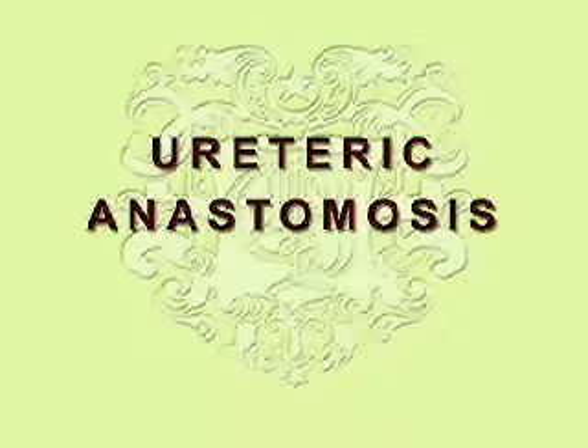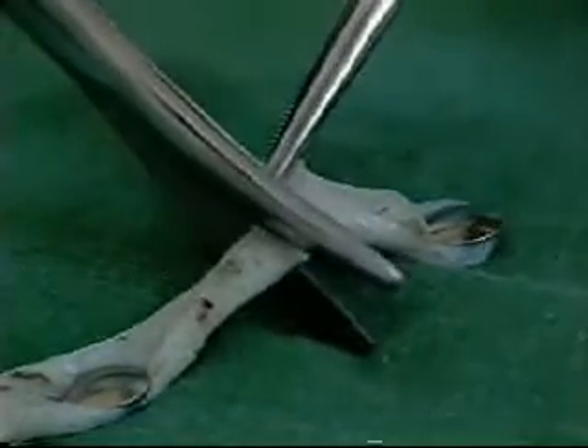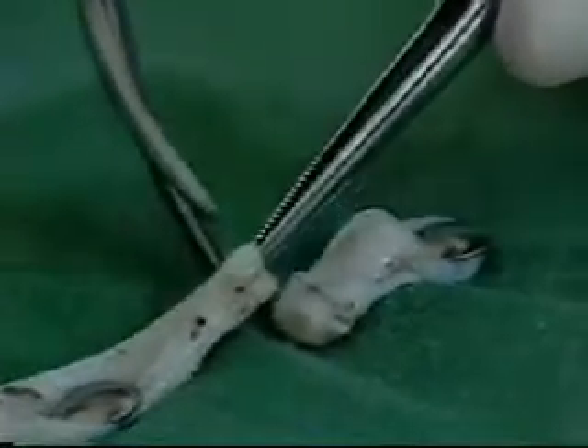We shall show you how to repair the ureter in an oblique fashion. You will be provided with a ureter, divide it transversely, and then repair it. This repair is done in an extra mucosal fashion using 3-0 catgut sutures. The first step is to obliquely cut the two ends of the ureter.